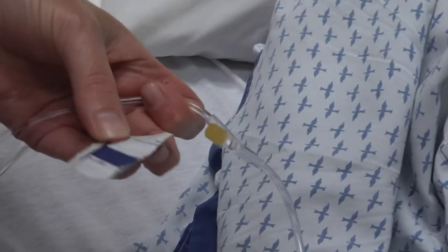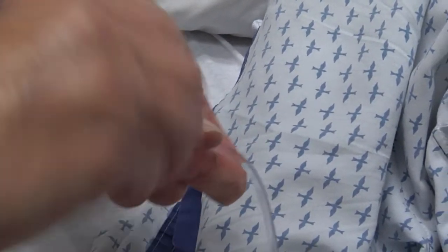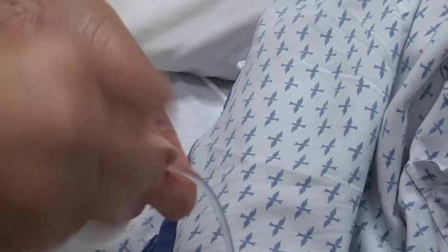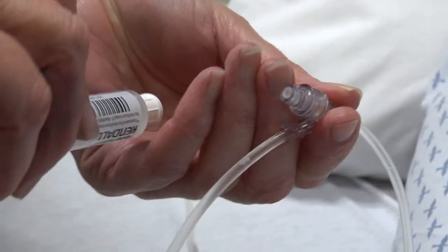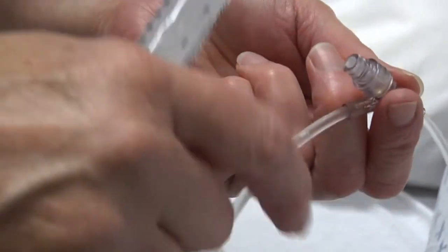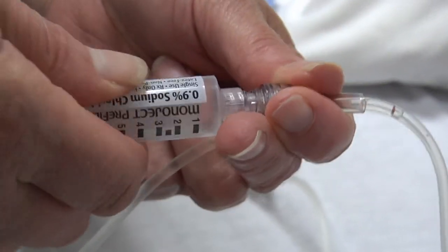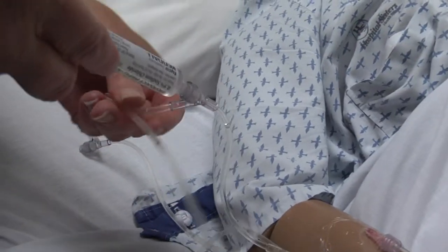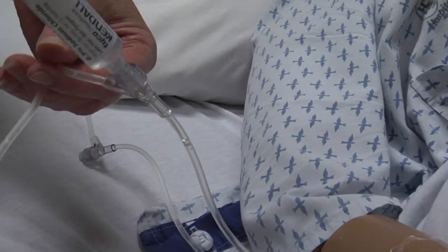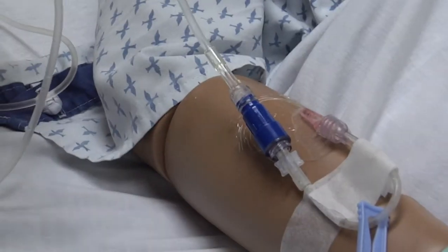I'm going to take an alcohol and clean that site vigorously for about 15 seconds. So we're cleaning it, making sure that we cleaned it for our 15 seconds. And then we're going to hook up the syringe. And now I'm going to pinch the tubing on the IV side. So this is the tubing that's going back up to the IV bag.